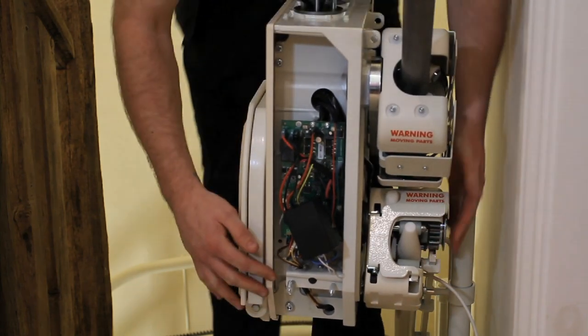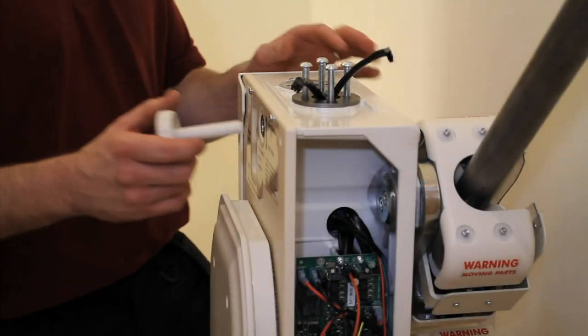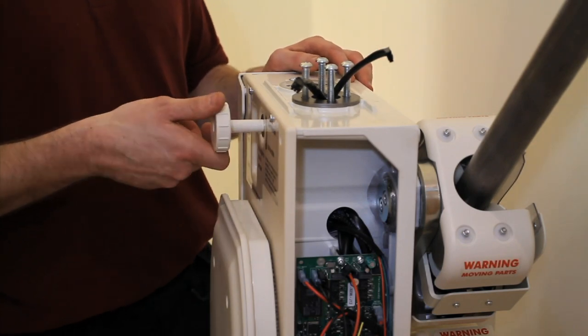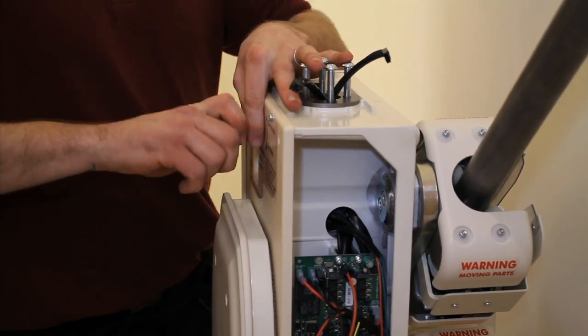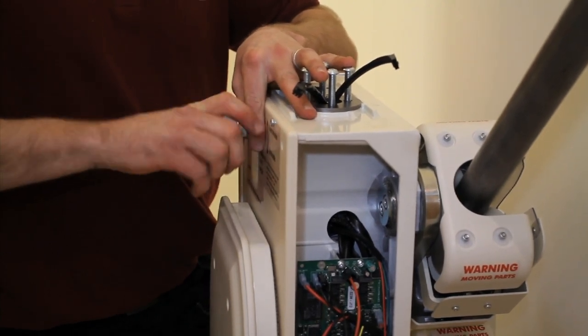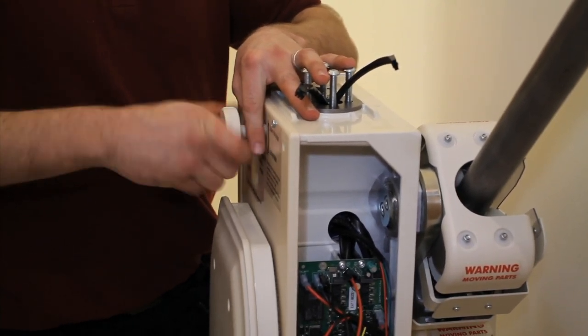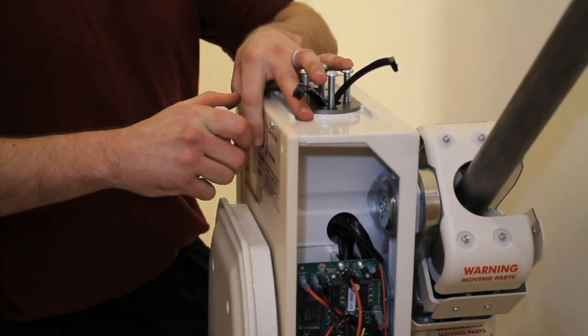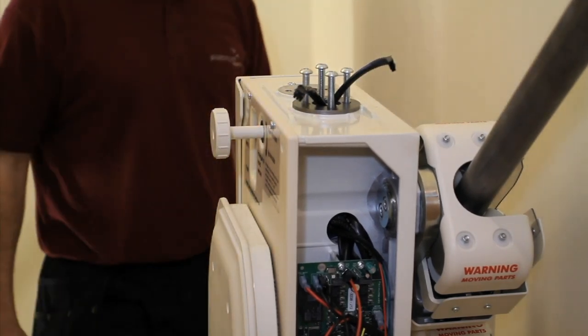Next you need to hand wind the carriage onto the rail correctly. Before you begin this, ensure the isolator switch is off. Insert the hand winder into the front of the carriage and turn until a loud click is heard. Hand wind the carriage down the rail for approximately 30mm or 1.5 inches.